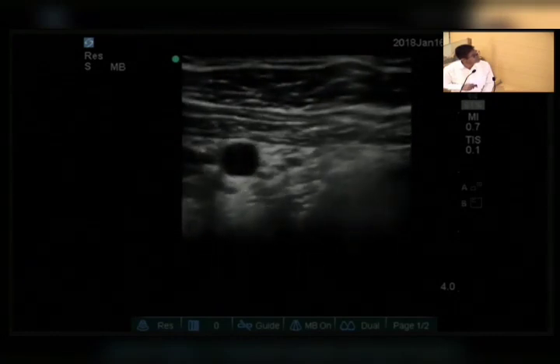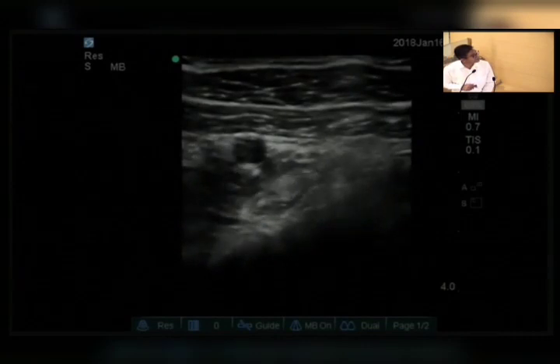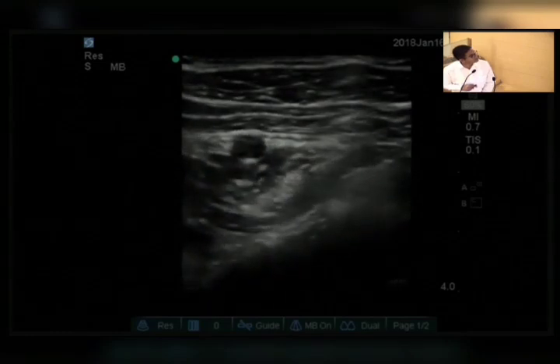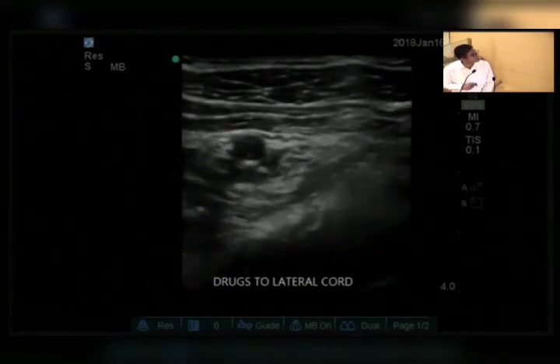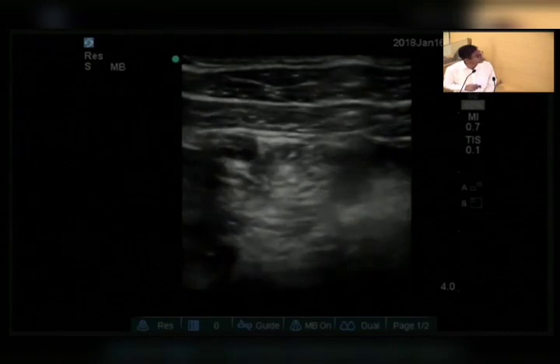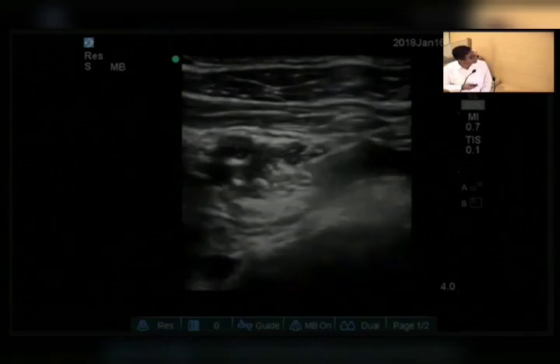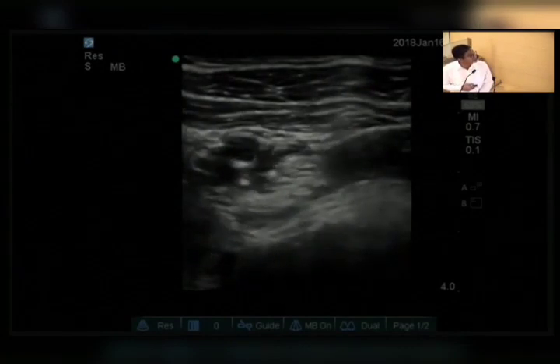If it is not proper, then I will again redirect my needle to cover the lateral cord over here, and somewhere here I am withdrawing the needle and targeting the lateral cord. This is the needle, and this medial cord we need to block with a separate muscle puncture, not a separate skin puncture, and I will enter in this area, and again inject 5 to 10 ml medially. So 15 ml, this is 10 ml, and this is 10 ml, reasonably 5 to 10 ml. So likely 25 to 35 ml of local anesthetic which I utilize in the infraclavicular approach.